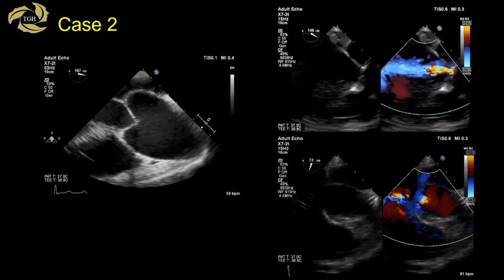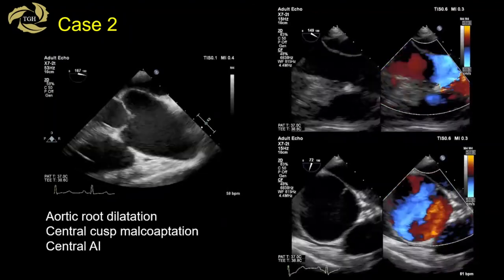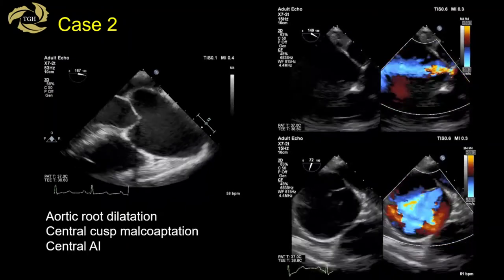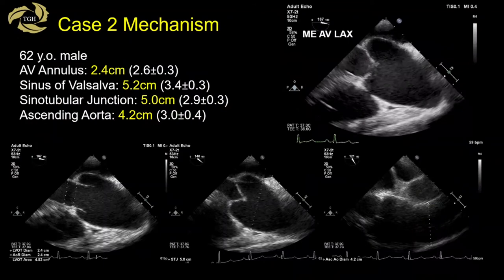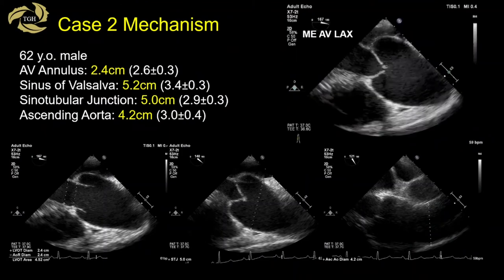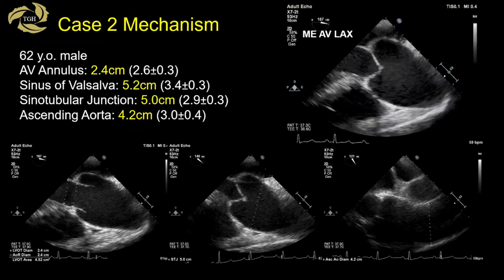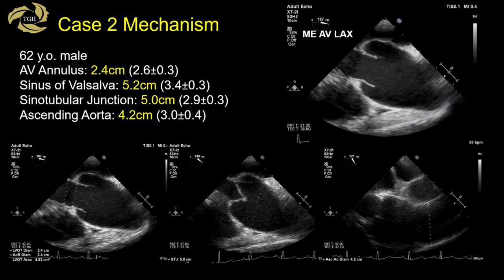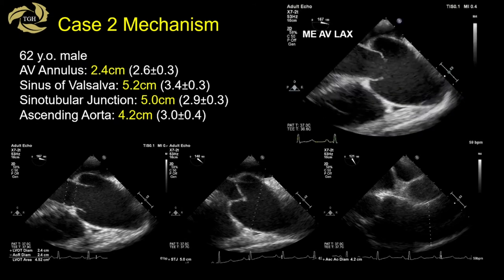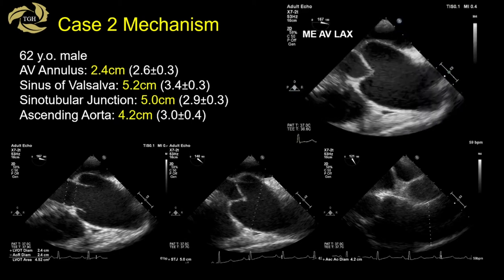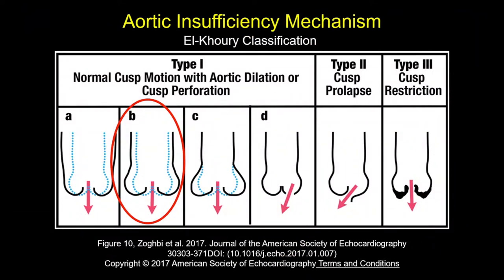We have a dilated root with central AI from central malcoaptation — a similar problem to Case 1, except now the aortic root is involved. Measurements: annulus preserved at 2.4 cm, sinuses are large at 5.2 cm, sinotubular junction approximately 5.0 cm, and the ascending aorta — measured by pulling the probe back and reducing the angle 20 degrees to align through the right pulmonary artery — is also dilated at 4.2 cm. This patient has a type 1b mechanism: dilation of the ascending aorta, STJ, and root, with a preserved annulus.